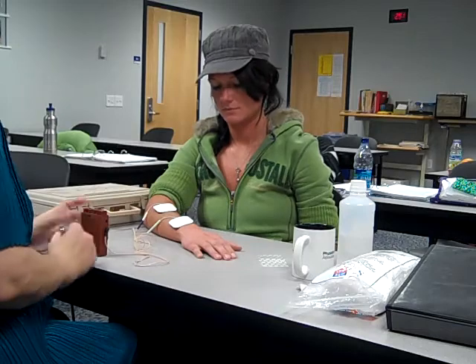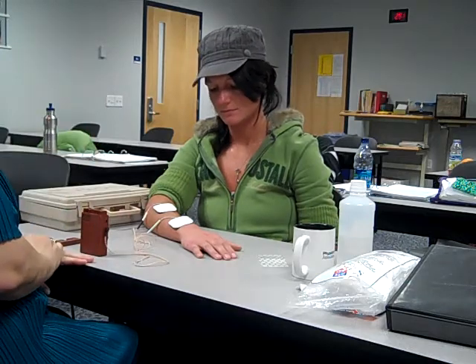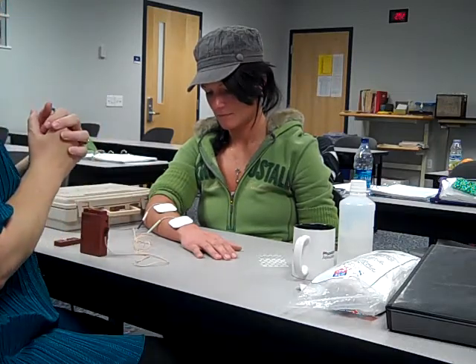Can everybody see that twitching? With the patient, we're going to leave that on just right at that point — just until there's an obvious twitch. How long are we going to leave it on? 20 minutes to 60 minutes, somewhere in that range. You want to go to 60 minutes if possible, but if they don't have any pain at 30 minutes, then you can take it off. So that would be the whole treatment for the low rate TENS.